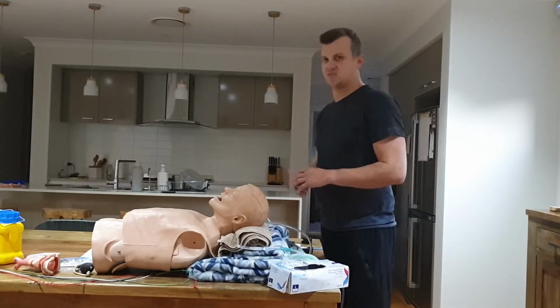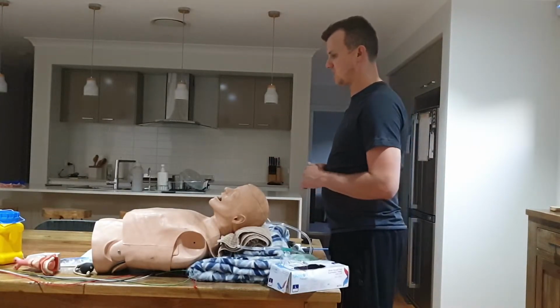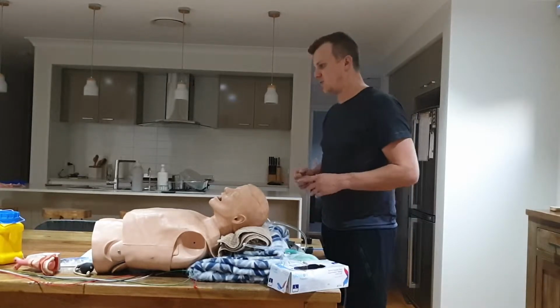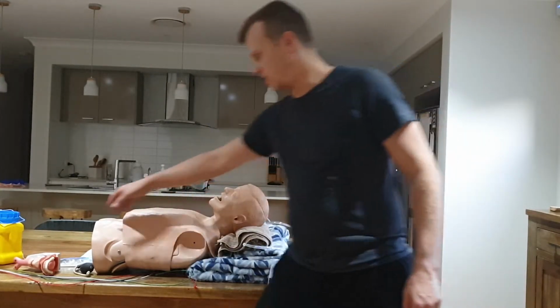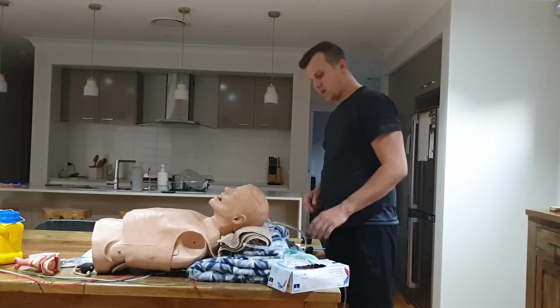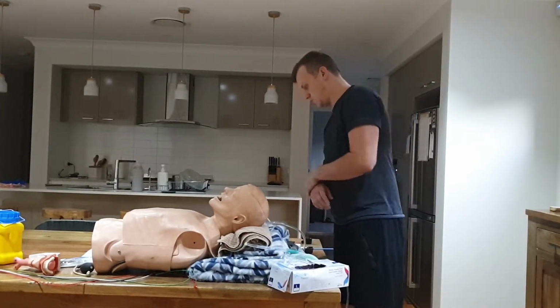So with the plan, it's just having open communication with everyone, discussing so everyone knows their roles, and if there's any complications, like a can't ventilate, can't oxygenate scenario, we know our backup plan. So we have a quick cric kit ready if we need to, with a scalpel and some preparation and a 6mm ETT tube there, if we need to do a front of neck airway. We then have our protective equipment, so glasses, mask, and also gloves as well.